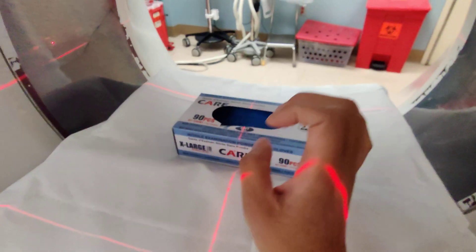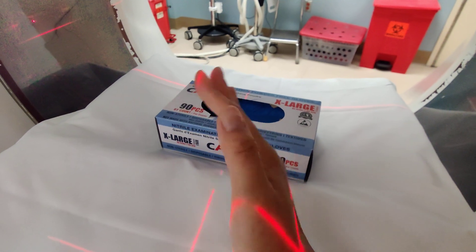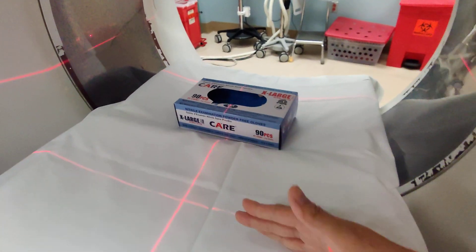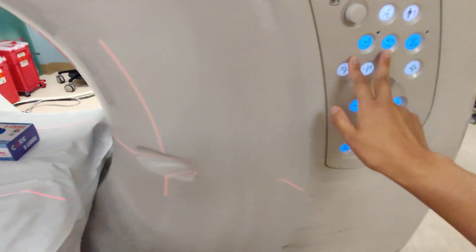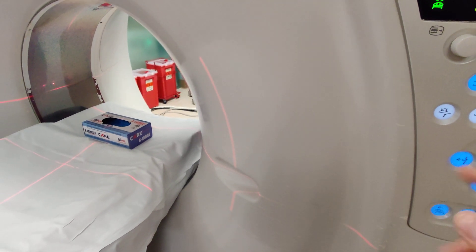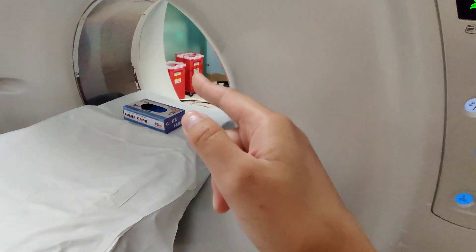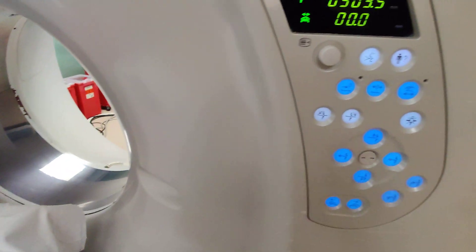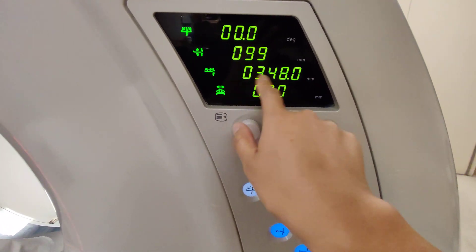So that's it — that's how you get your scan, and you can do that with anything, just as long as you measure where you need to be. From zero to whatever, set your light, and then reset where you need to go. Because technically you're going to go back and zero it out on top of the chest. You're just doing it to see how much length you need.